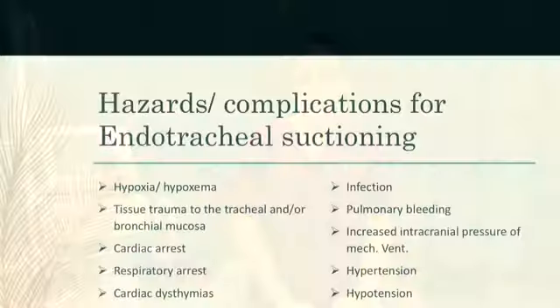The contraindications are as follows. Endotracheal suctioning is a necessary procedure for the patient with artificial airways. Most contraindications are relative to the patient's risk of developing adverse reactions or worsening clinical condition as a result of this procedure. When indicated, there is no absolute contraindication to endotracheal suctioning because the decision to withhold suction to avoid possible reaction may be lethal.